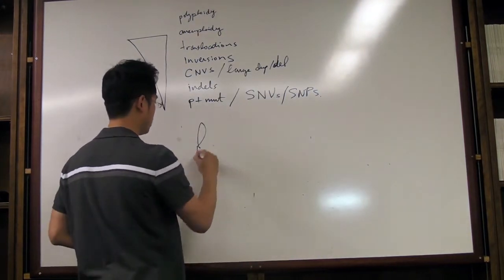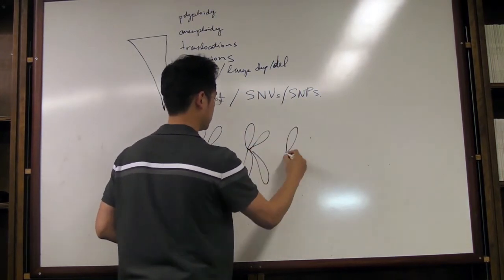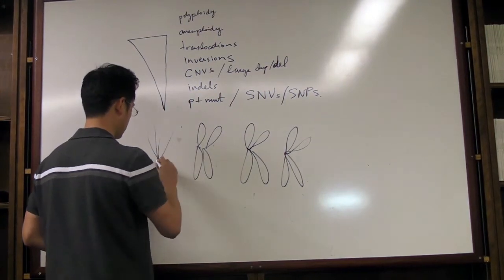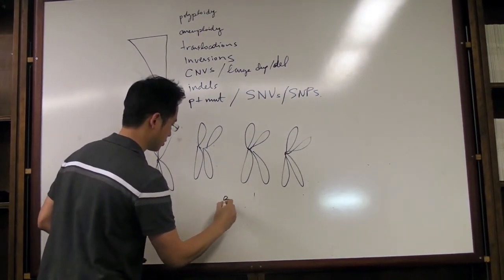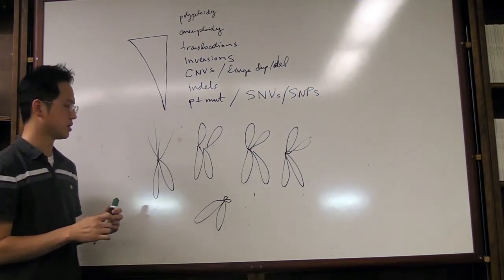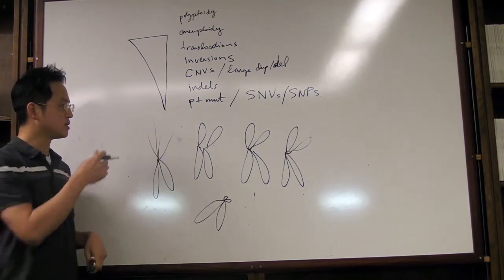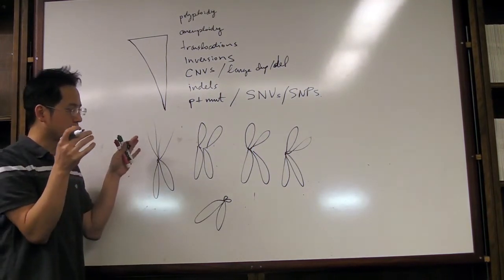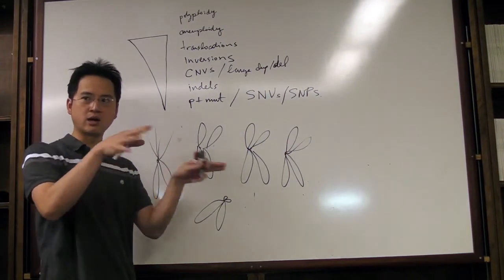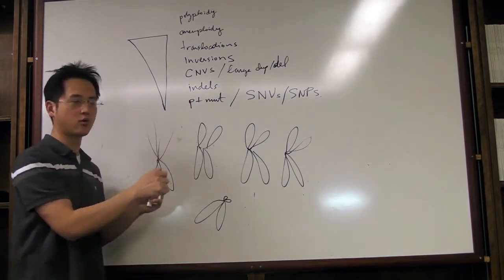So with a karyotype, you essentially have your sets of chromosomes all laid out like this. Sister chromatids, all beautifully laid out. And depending if it's acrocentric or not, the chromosomes have different sizes. And what happens is that when the chromosomes are condensed down, and let's say you do your dropping already, right? And you have the spread. The chromosomes are condensed into their metaphase form here.